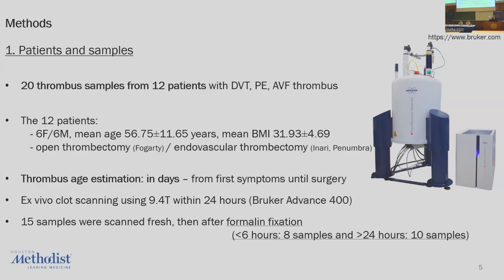We scanned these clots in an ultra-high resolution 9.4 Tesla MRA. 15 samples were scanned at their fresh state, and then after formalin fixation, which enabled repeating measurements.